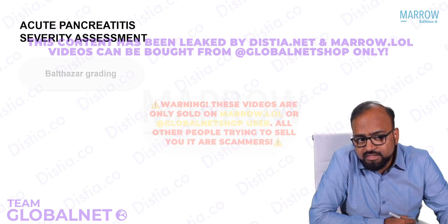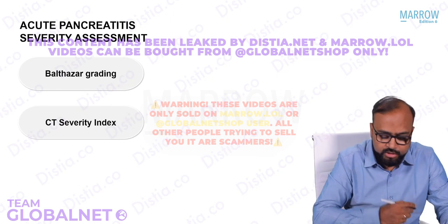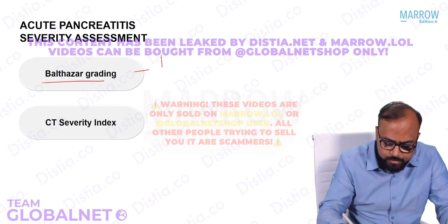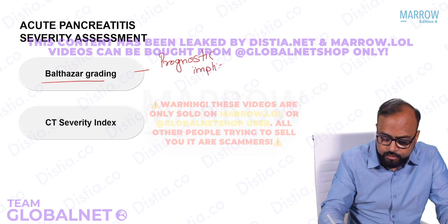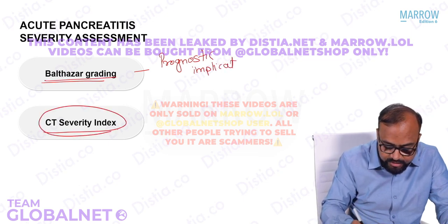Now how do we assess the severity of pancreatitis? It is done in two ways. One is called the Balthazar grading system. This has a little bit of prognostic implication. These names you must know: Balthazar grading system and CT severity index.